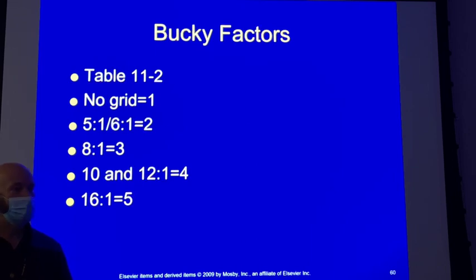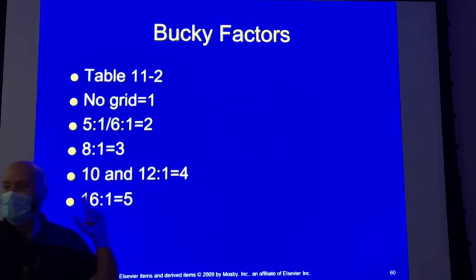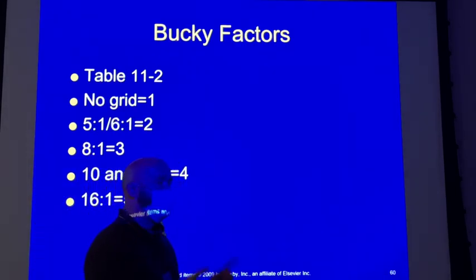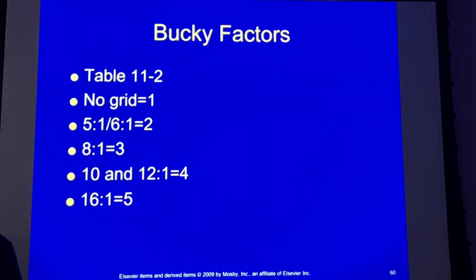Answer is no. No, it's not. So you go ahead and shoot the KUB for the feeding tube placement without a grid, just so that they can start it, right? Because really for feeding tube placement, you're doing a low chest x-ray, high KUB anyway, and you're looking for something specific. But they see a shadow on that KUB, and they say, I need a clearer image. So now you go down to the floor and you get a grid.